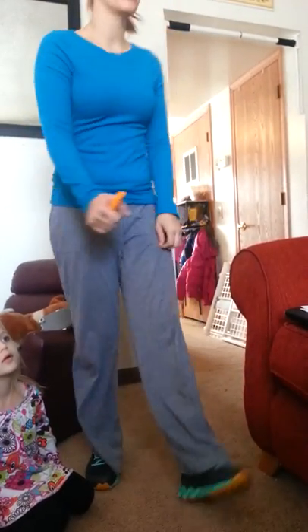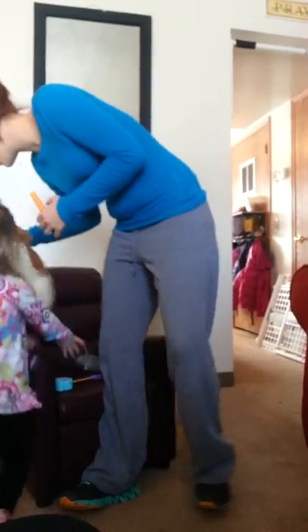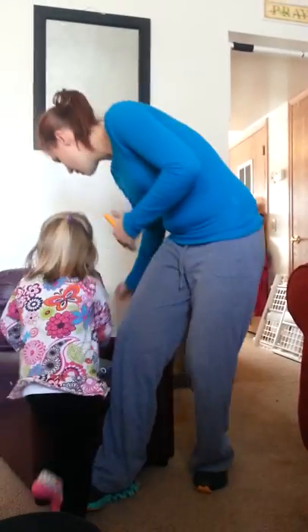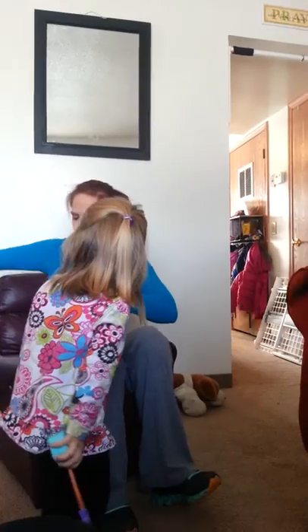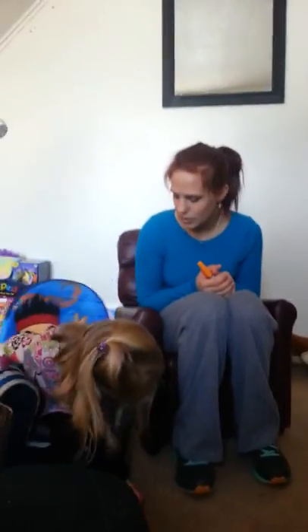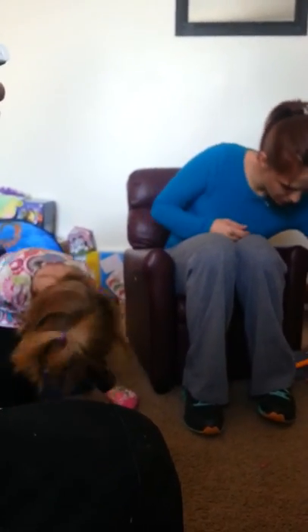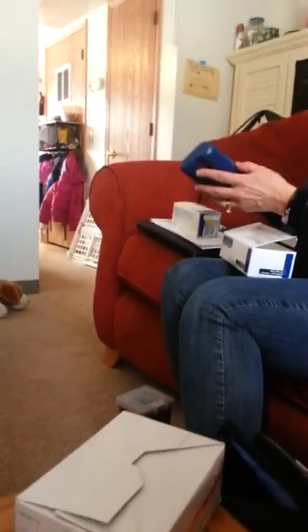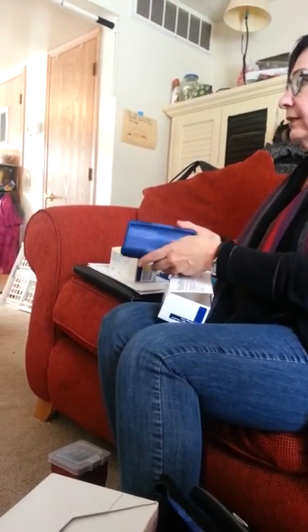Okay, the first time we use a new pen. Now, where's our needle? Okay. What did I do with that bag? It's right here. Oh, it's behind you. It's behind you. Oh, it's underneath. I'm going to sit in this one. You can figure it out, but it's a nice little carrying case. And it holds the needles too, in here.